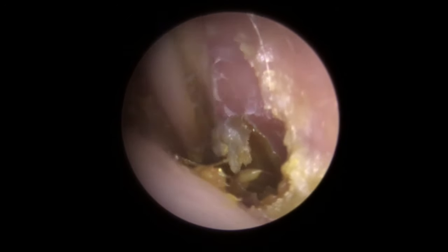We'll just stop at this point — let the patient oil it for a week. They'll come back and see if we can remove it. But we have got them hearing a lot, lot better. See, it's just that groove — it's tucked in on the side of the hammer bone, basically. Just a little groove there, unfortunately. But the rest of the eardrum's clear. So just over three quarters of a centimetre — I'm going to say just under half an inch for that one.